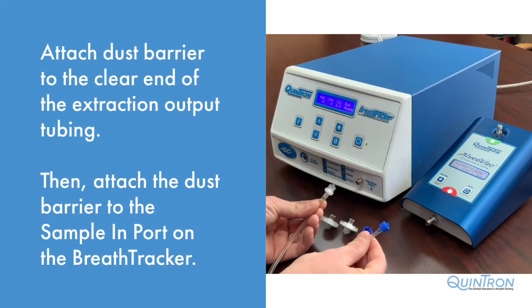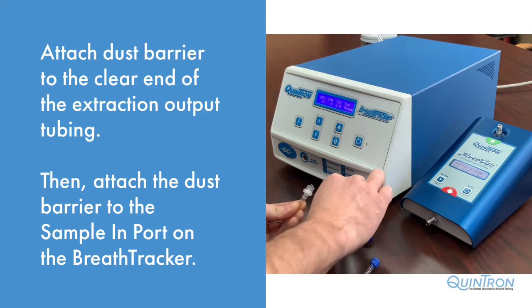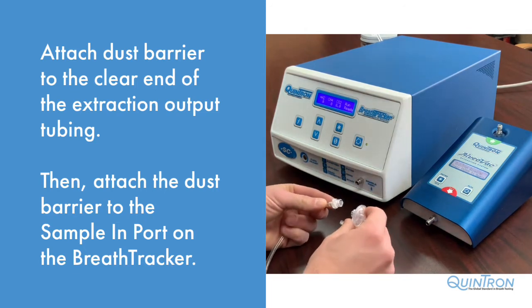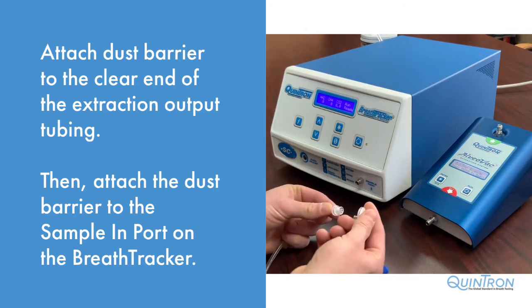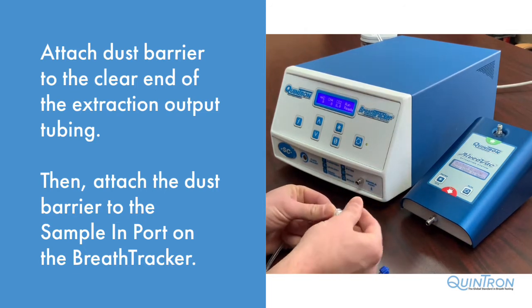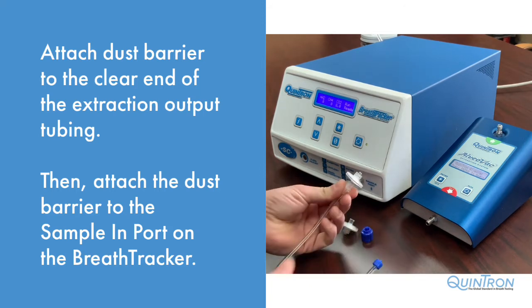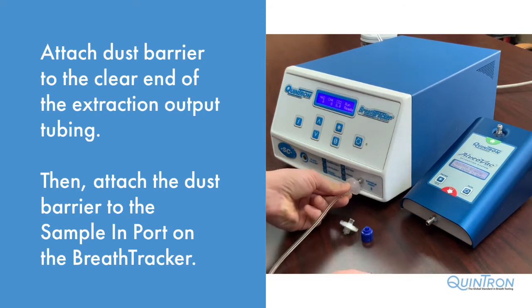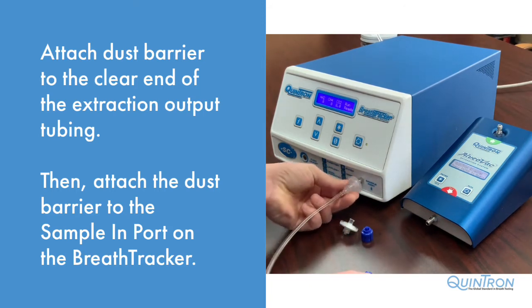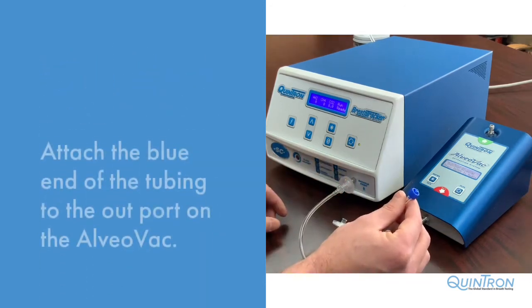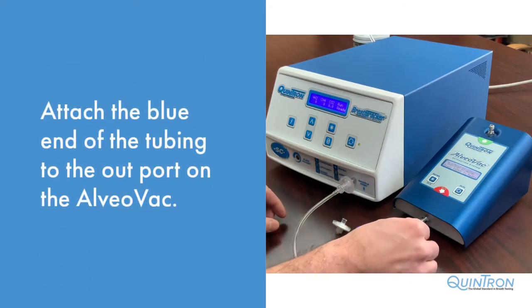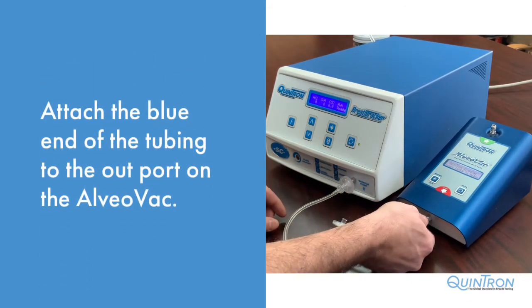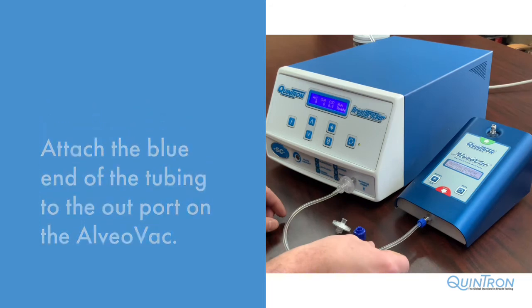Attach one dust barrier to the clear end of the extraction output tubing, and then attach that dust barrier end to the sample in port on the front of the Breath Tracker. Attach the blue end of the output tubing to the out port on the Alveobac.